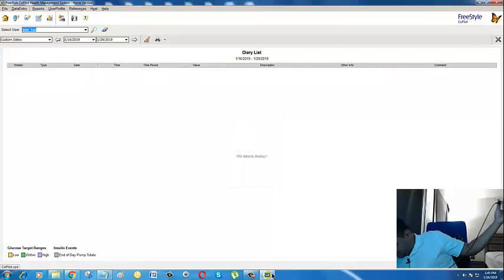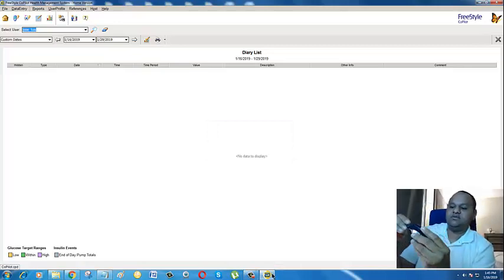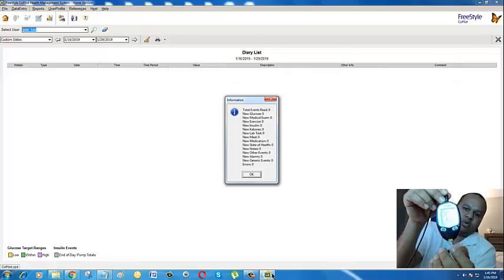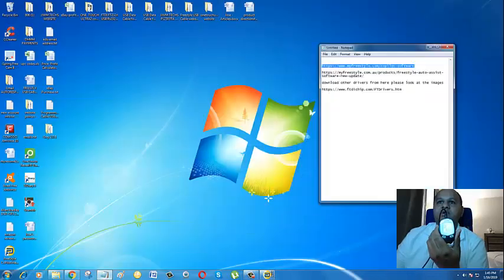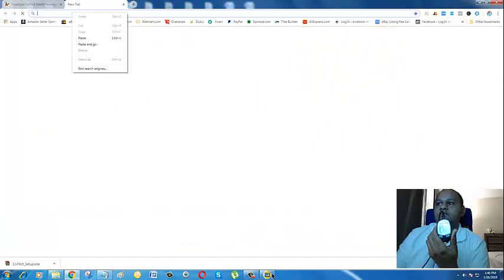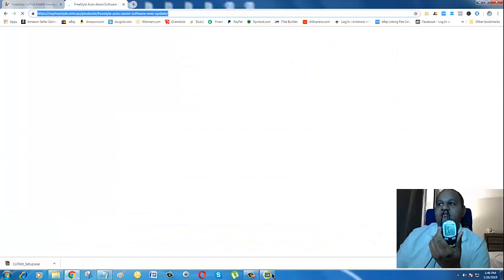I'm connecting the USB port of my cable to my CPU. My meter is still displaying PC on the front, which is a good sign that it's compatible with my PC and cable. I'll give the software a couple more minutes to install — it's taking a bit long, probably due to my slow internet connection and the recording software running simultaneously. I'll pause the video and come back once the software finishes downloading.